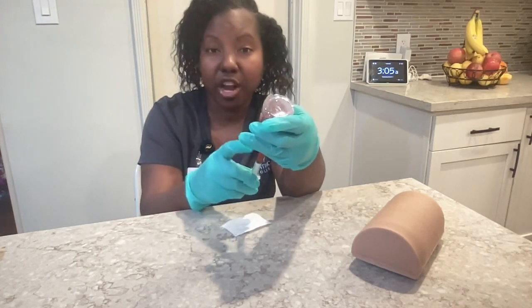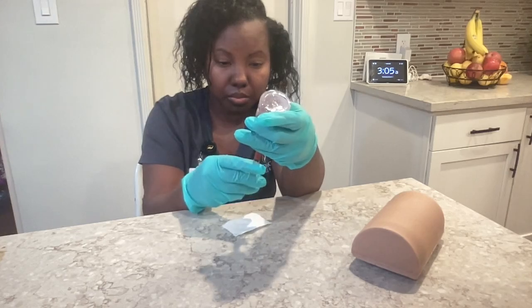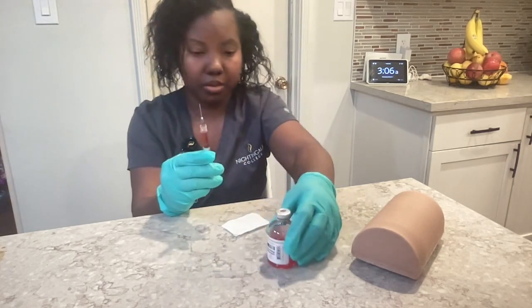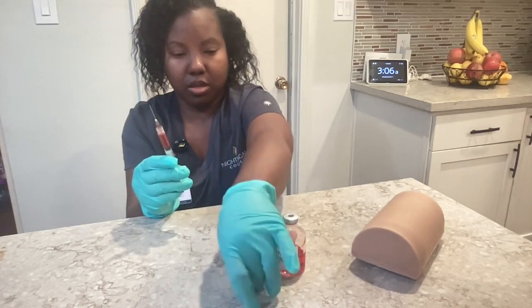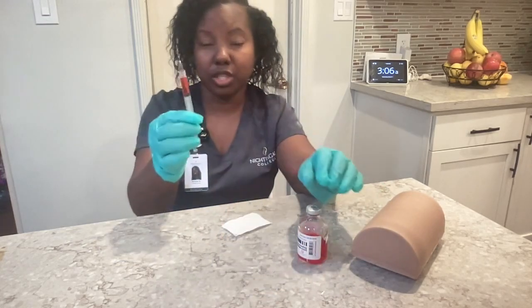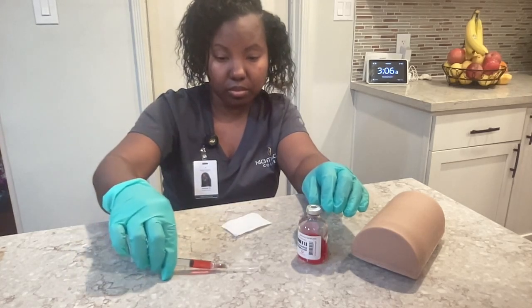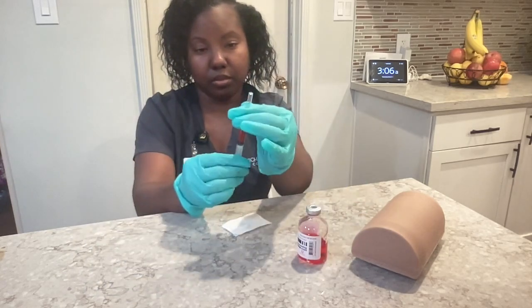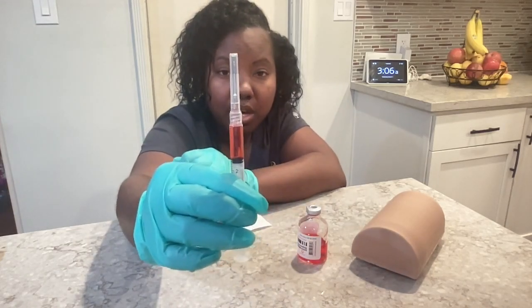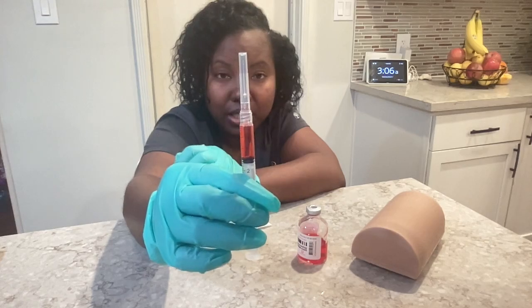You want to tap to remove any air bubbles. Since I am not going to use this right away, I am going to do the scoop method to put the cap on. So I have 1.5 milliliters of the morphine — that is 1.5 milliliters or 6 milligrams.